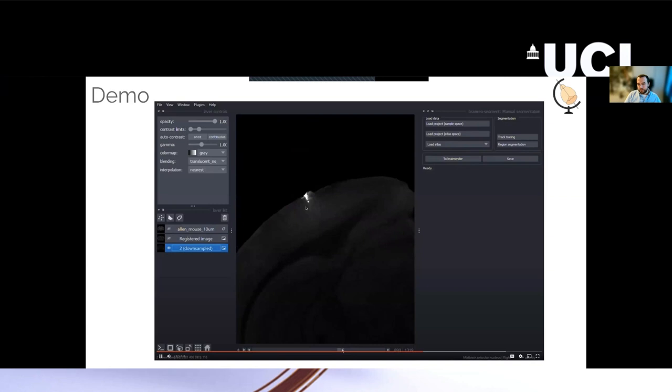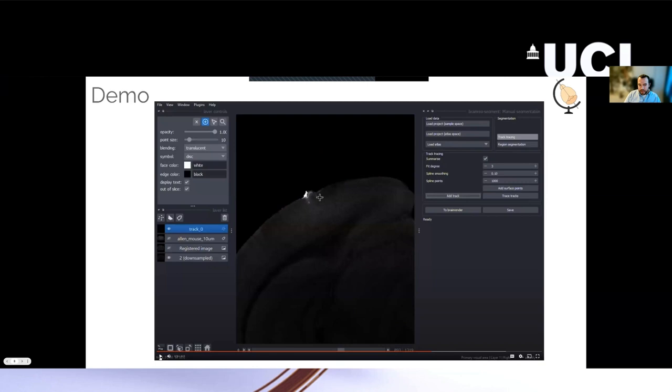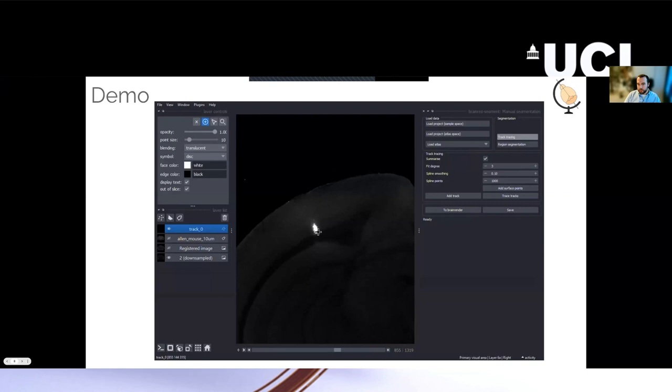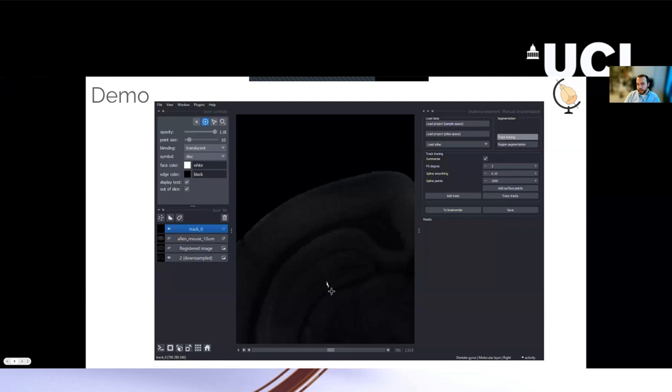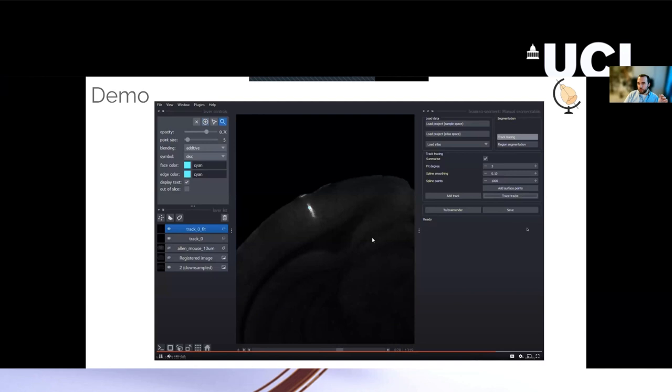And to segment this out, we use the track tracing option within BrainReg Segment, and basically all you need to do is select regions along the probe. Five or six will probably do it, just reasonably evenly spaced to pick out the probe track, making sure that you go right to the very end of the probe track, which can be a bit tricky. But you can zoom in and change the contrast. And then once you've done this, there's a button Trace Tracks. What this will do is basically join up all these points with a fit that you can determine, and you can choose the number of points along this fit for which the brain region will be reported.